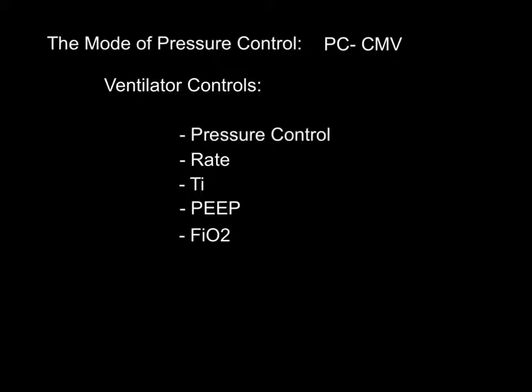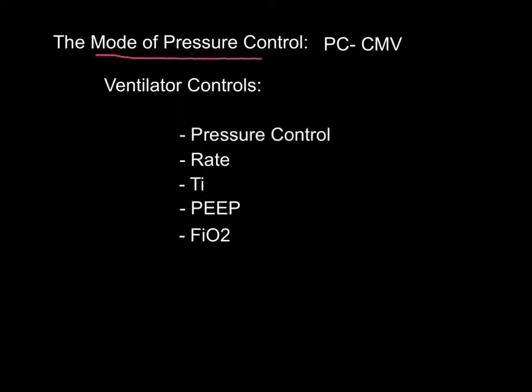Now, before we can discuss the factors that affect inspiratory flow during the mode of pressure control, we have to really understand the mode of pressure control very carefully. Sometimes it's abbreviated as PC-CMV. Now, the pressure control we're going to talk about is an absolute pressure control level.